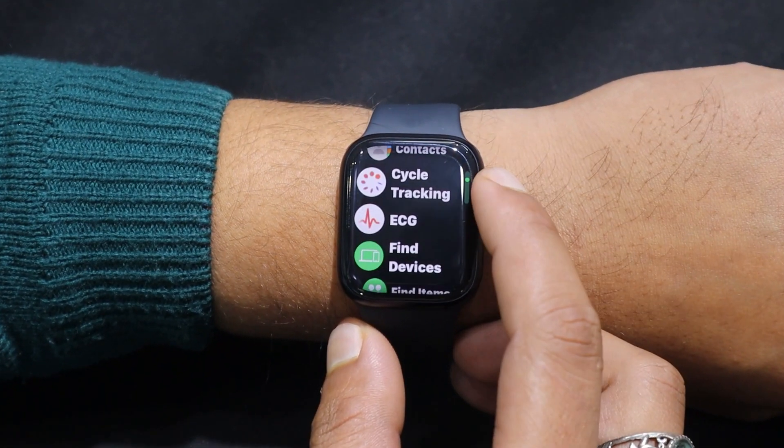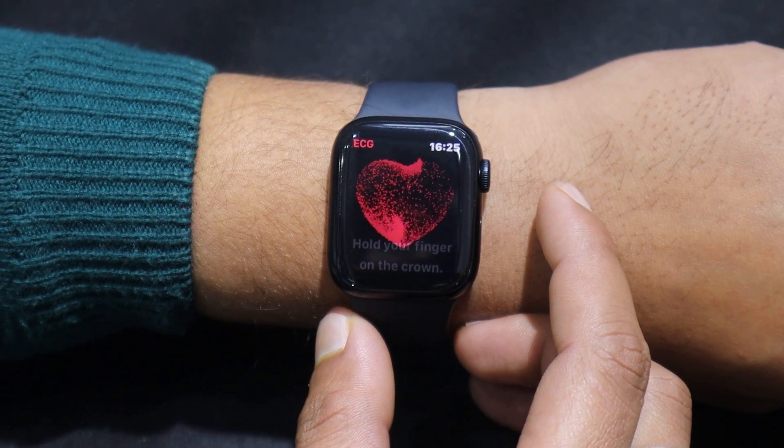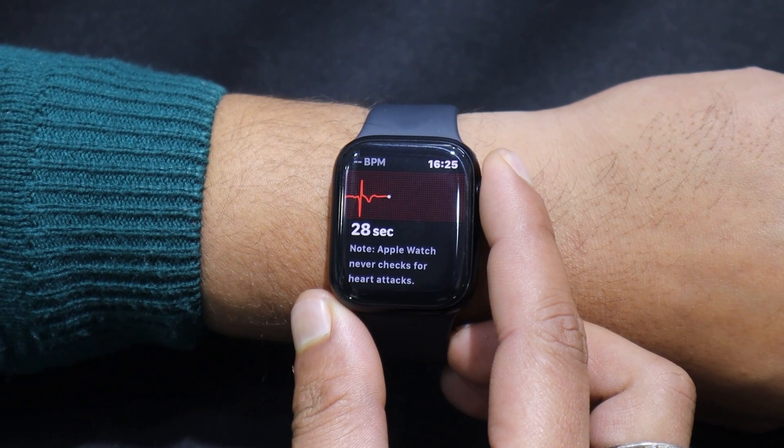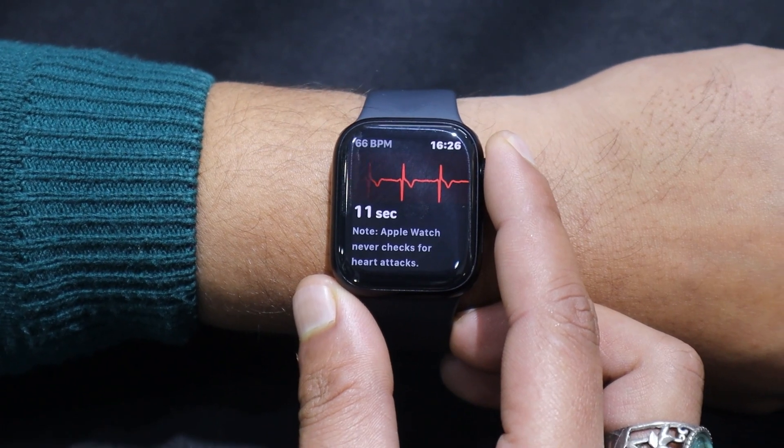Here is my Apple Watch Series 9 and I have opened the ECG app. My arm is in a resting position and to measure the ECG, I touch the digital crown button with my finger. It takes up to about 30 seconds, so I have fast forwarded the video.